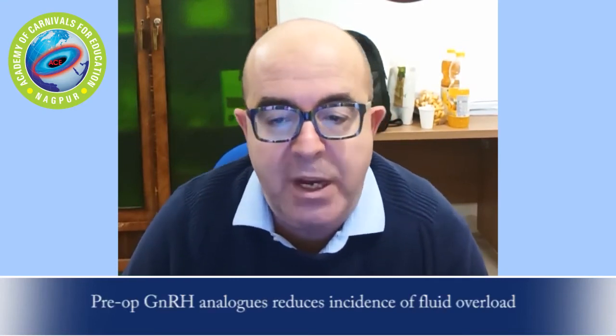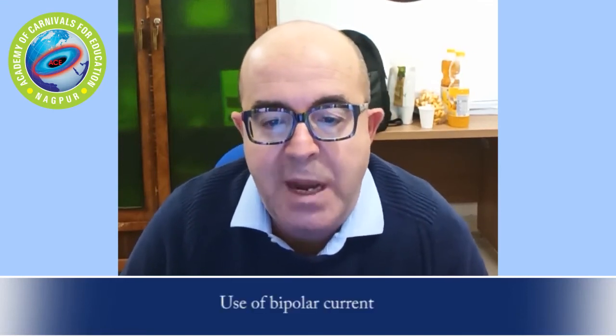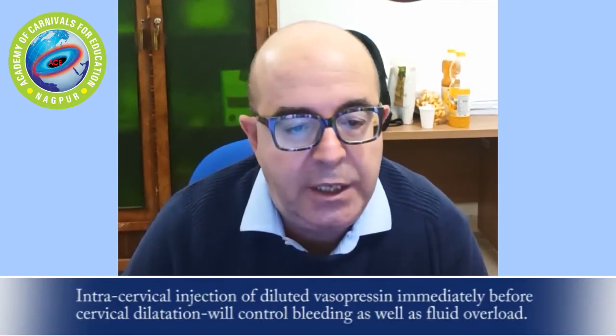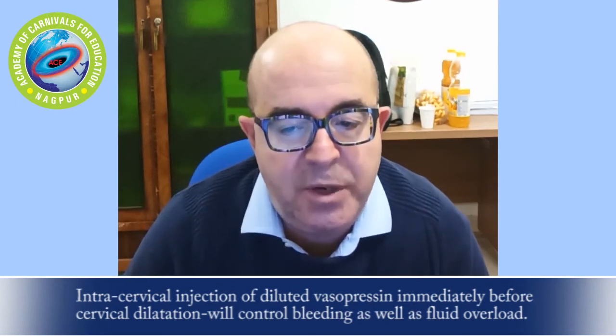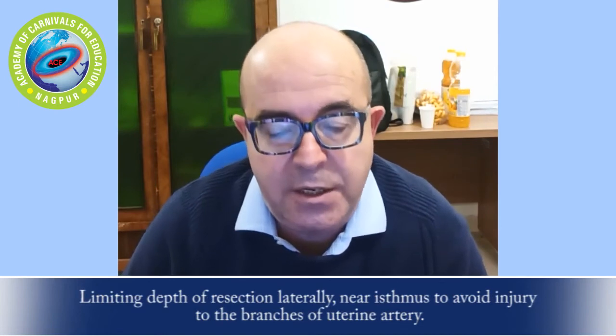Always adequately evaluate the patients, whether of reproductive age, parous or not, such as nulliparous, or in menopause, for crossing the cervix without complication. It is recommended to use bipolar surgery if you do not have sufficient surgical skill. Adequately assess the type of fibroids to be removed, G0, G2, the diameter of the fibroid to be enucleated, the minimum distance from the serosa, and the skill of the surgeon.